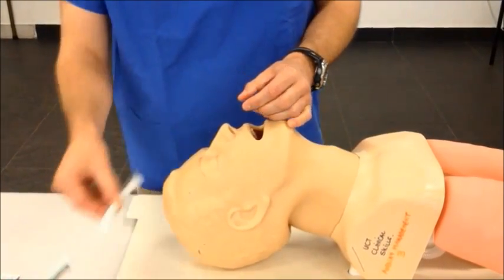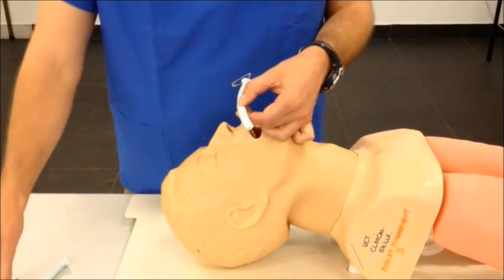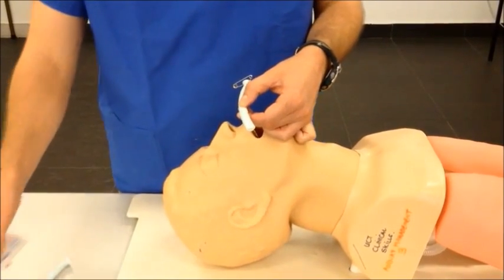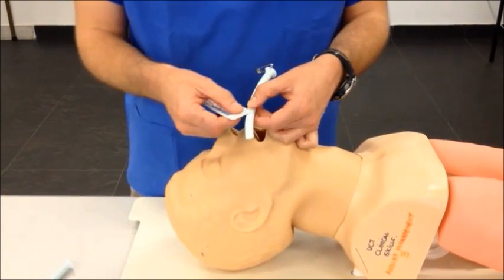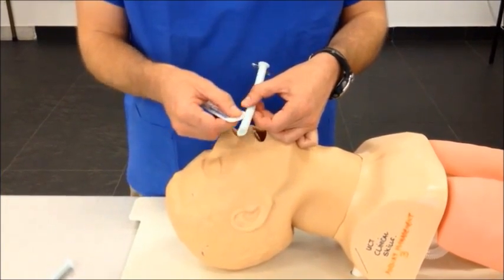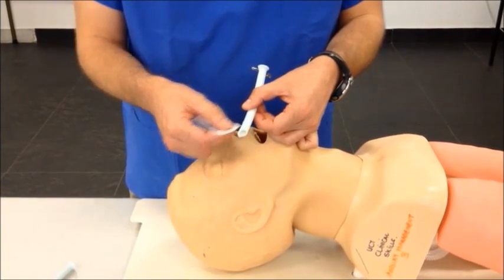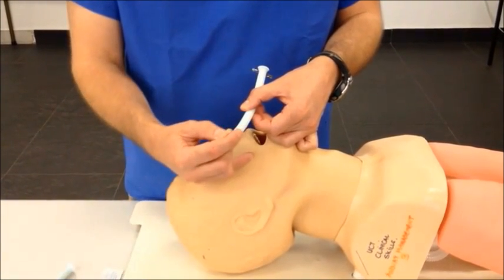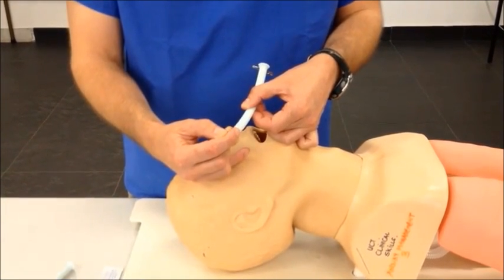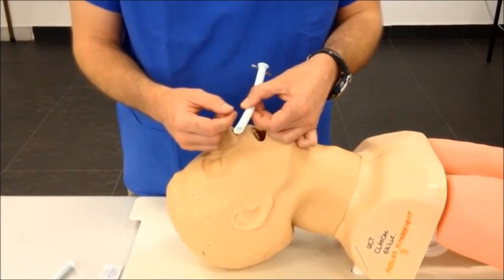Before inserting the nasopharyngeal airway, consider applying a water-based lubricating gel to the distal end of the nasopharyngeal airway, taking care not to get any of the gel into the tip as this would cause airway obstruction.